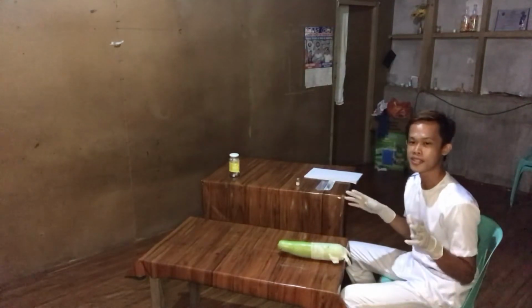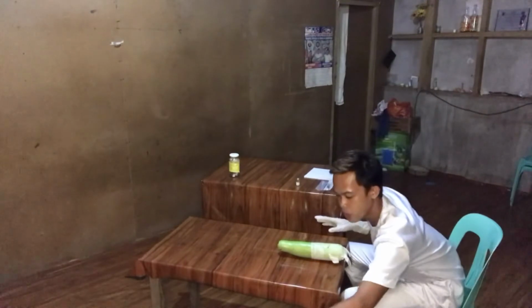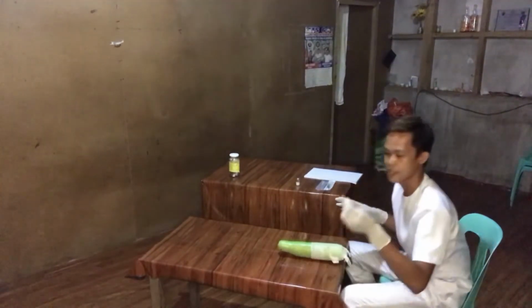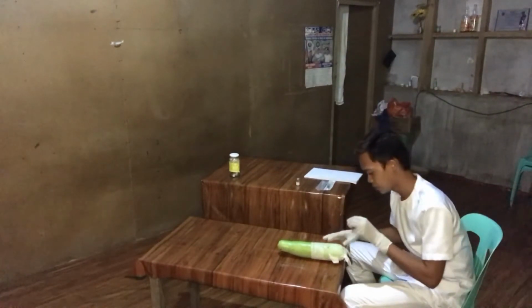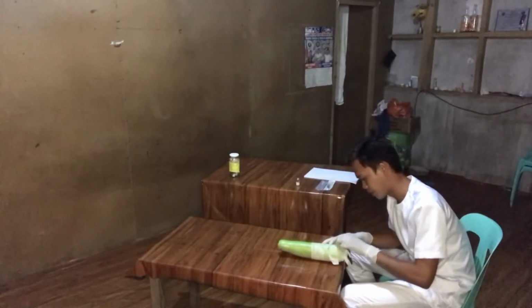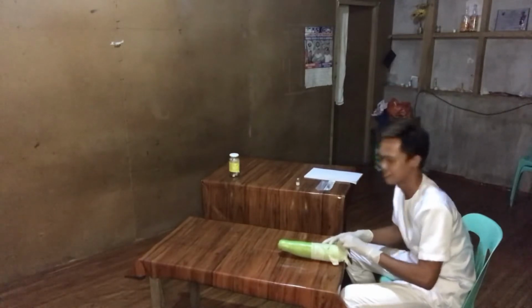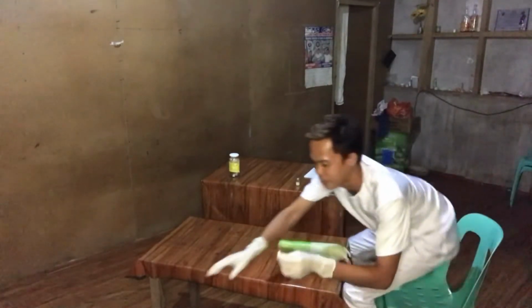Use an antiseptic swab to clean the site. I'm going to use a cotton ball soaked with 70% alcohol, and we're going to rub it in a circular motion on the injection site. And then we need to place it in the waste receptacle.